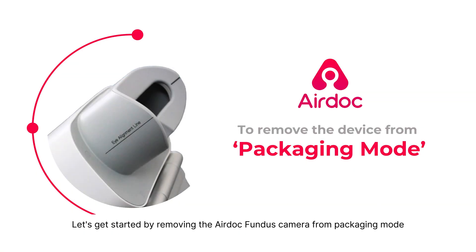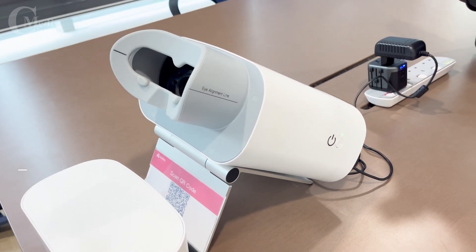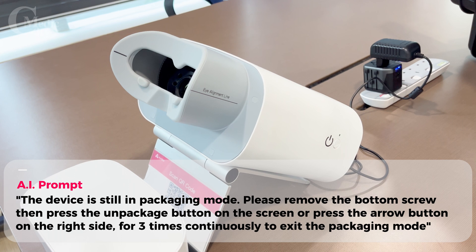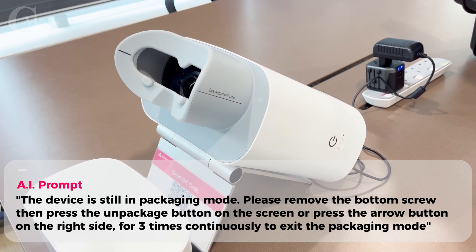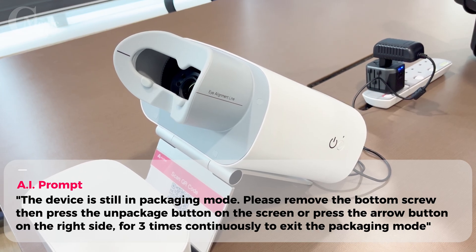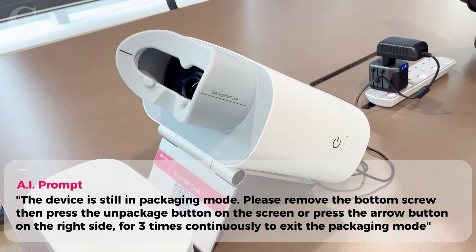Let's get started by removing the AirDoc Fundus Camera from packaging mode. The device is still in packaging mode. Please remove the bottom screw, then press the Unpackage button on the screen, or press the arrow button on the right side three times continuously to exit the packaging mode.